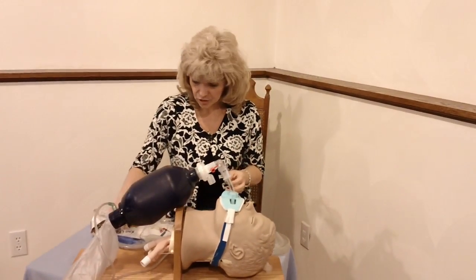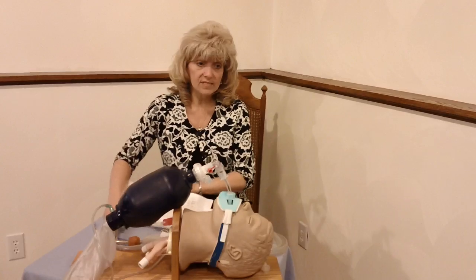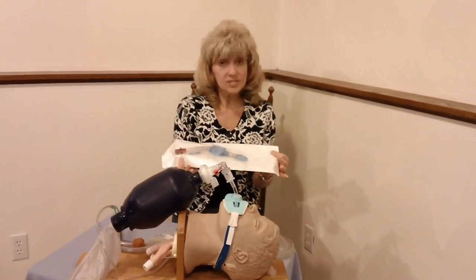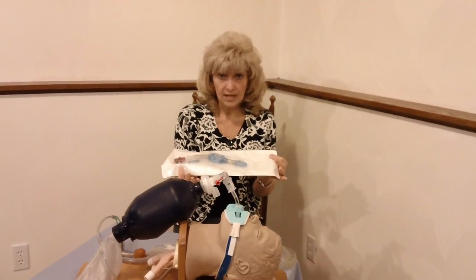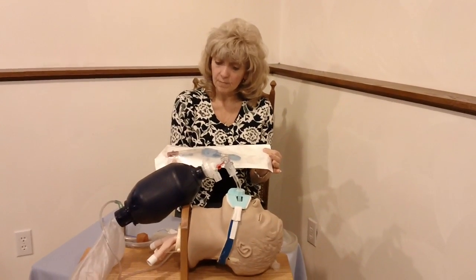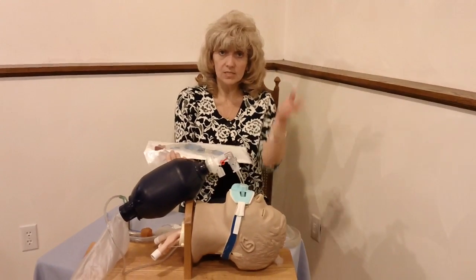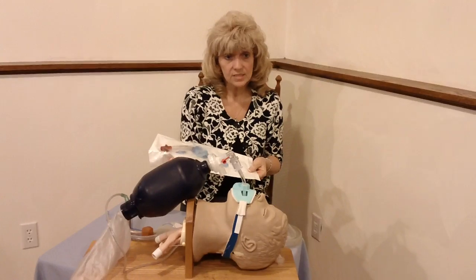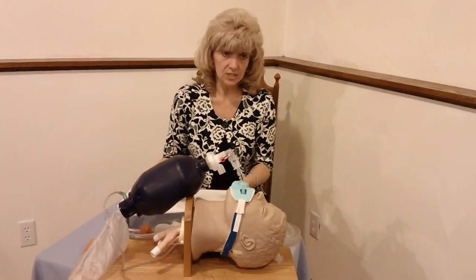We also have the laryngeal king tube, which I do have a sample here. This is based on our color scheme. There is yellow, red, and purple colored tubes. These are also done without a stylet. They're just directly inserted in, and this is the airway of choice for surgical patients.